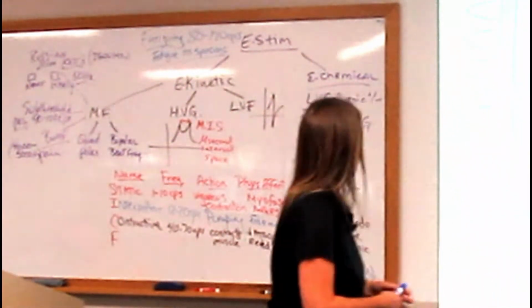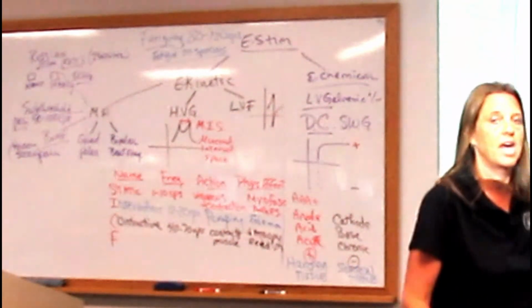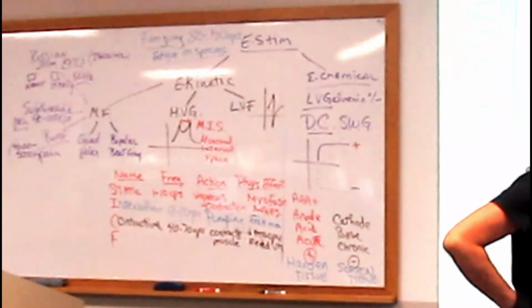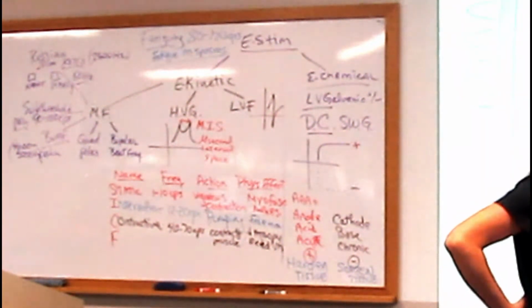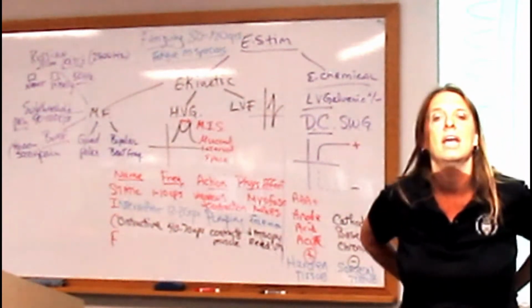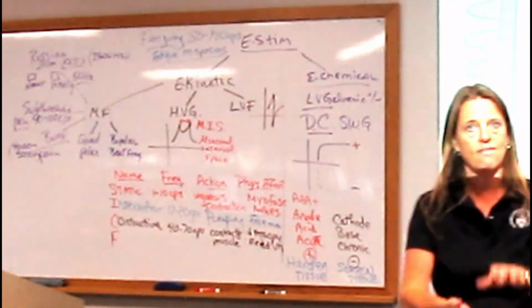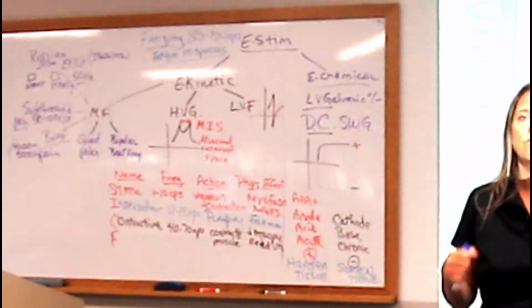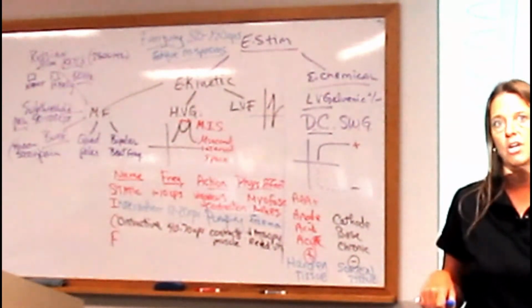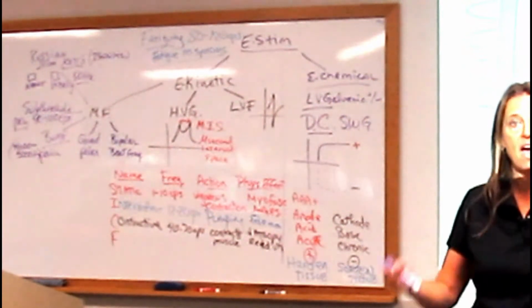So when I'm looking at using one of these motor nerve stim modalities for my patients, let's say it's a low back spasm, I'm going to put the pads on the low back where I want to surround the area or be on the area, and I'm usually going to use a fatiguing tetany. With this one, you need to have it on for at least a 5 to 1 ratio. Now, most new machines don't offer the old 5 to 1 ratios. Some of the old ones still do, so you can use that. But often you'll have to go to a 5 to 5 ratio.